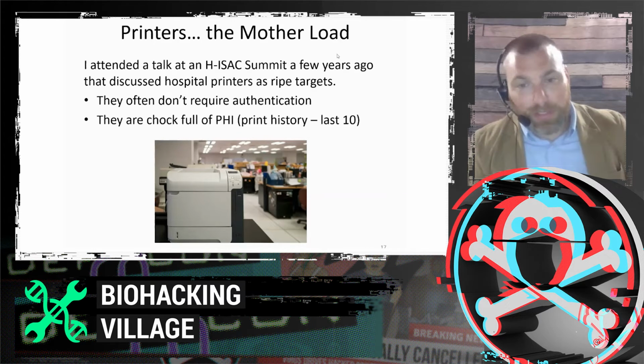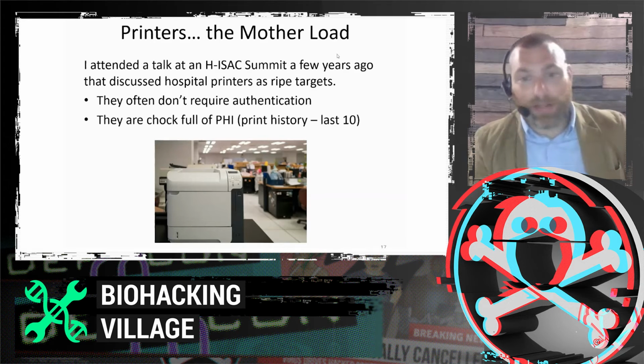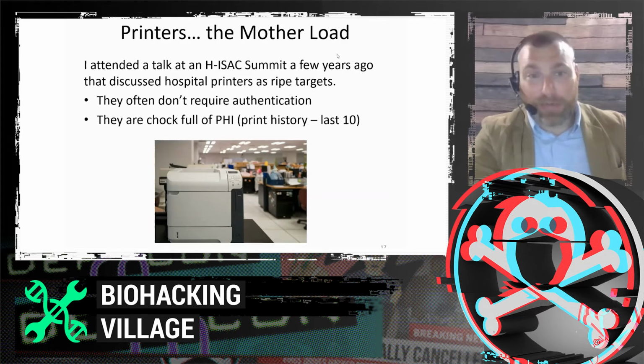So that printer is chock full of records. It's probably right next to an exit door, and it may or may not require authentication. So just something to think of. Printers often get overlooked, but one might have just as much, if not more, PHI than an actual medical device.